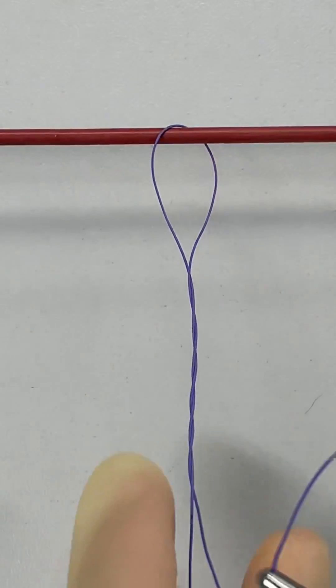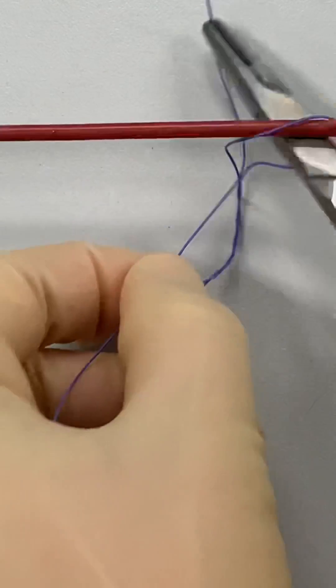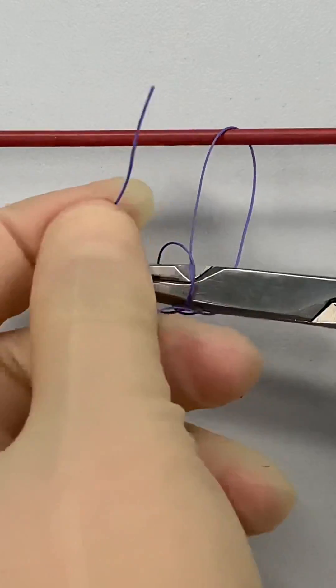This creates some twists with a loop at the base through which the short end is passed. This creates a new loop and the short end is passed through that one too.